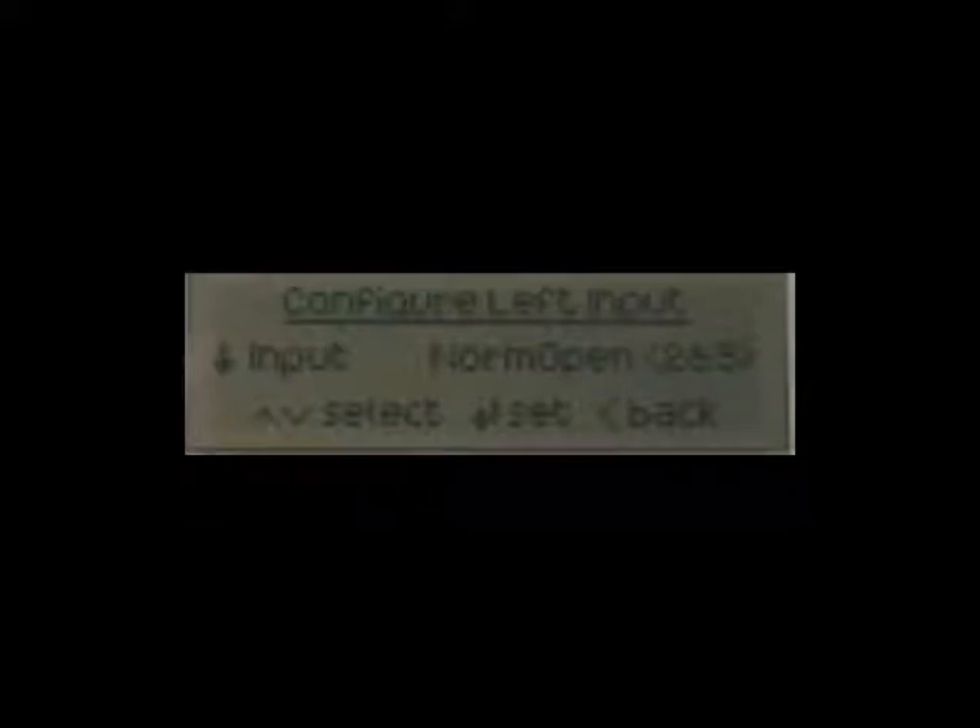When used with a paper thin bed sensor, the input configuration should be set to read normally closed pins 2 and 3. Once selected, if you navigate back to the main menu by pressing the standby button momentarily, you will notice that the unit will alarm immediately.